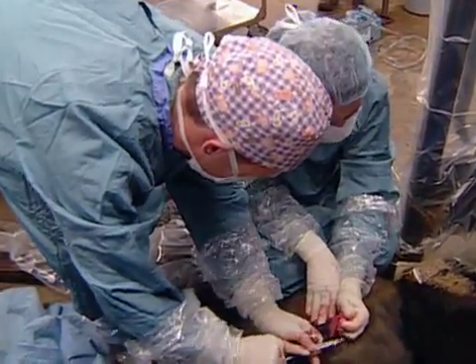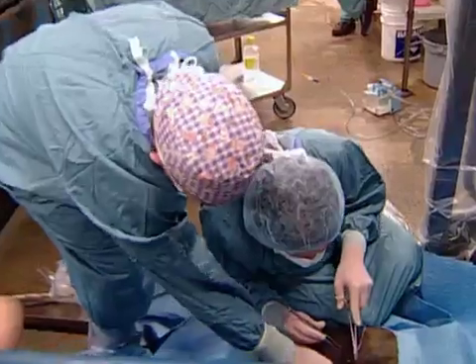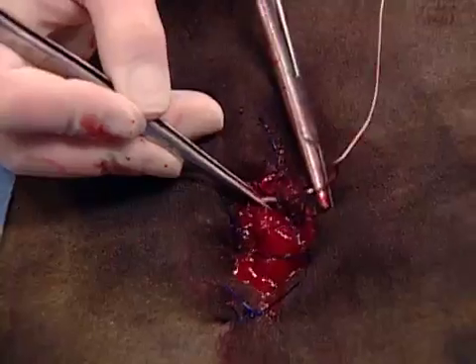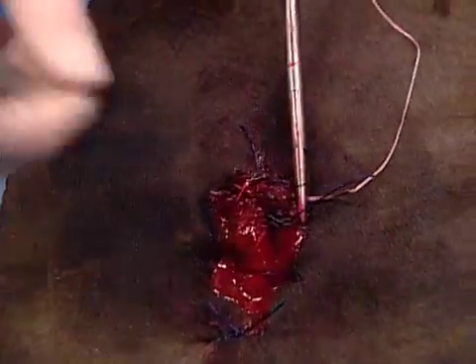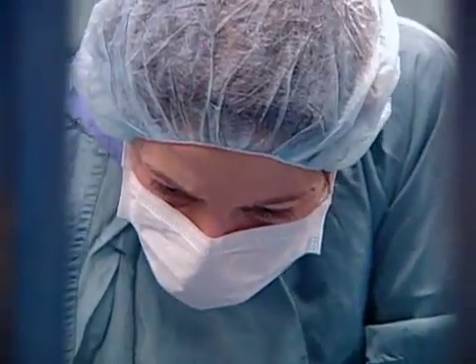Student Tara Trimble is learning the first lesson of this surgery: not to let go of the rumen as it's contracting. Once they've made the hole, Tara stitches that section of the rumen to the body wall. When it heals, the opening will become a pressure valve of sorts.